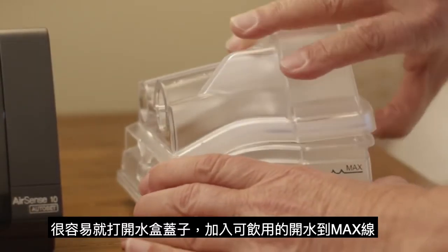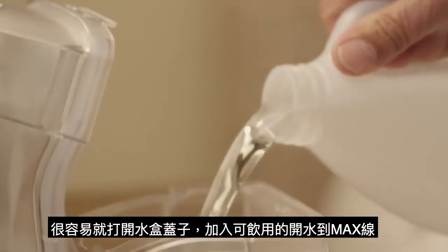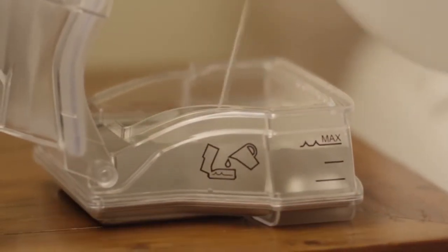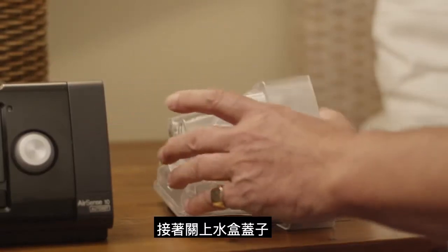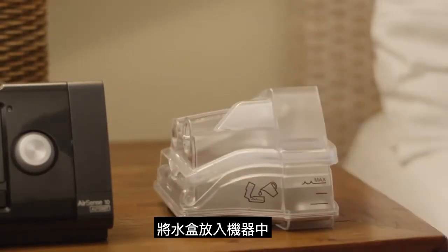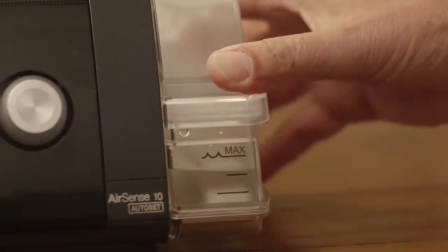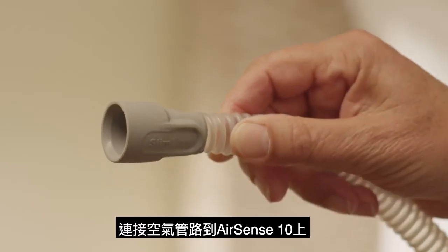Simply take the water tub, open it, and fill it to the maximum water level mark with distilled water. Then close the tub, insert it into the side of the device, and connect the air tubing.